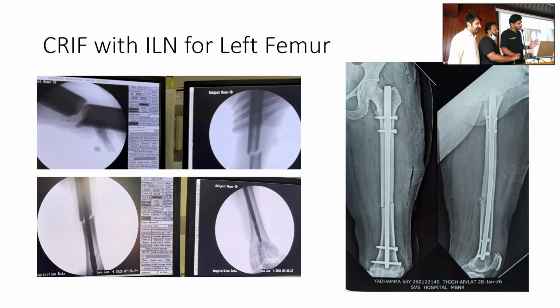Where did you thump? On the heel, or the knee? Can it transmit right up to the fracture? We held the distal thigh and flexed the knee, and thumped. Not on the heel, it cannot get transmitted so long. Usually the traction is there, and that also fails unless the medullary canal is very wide.